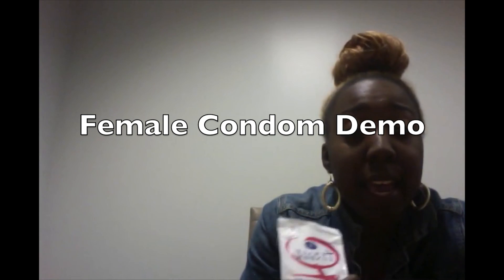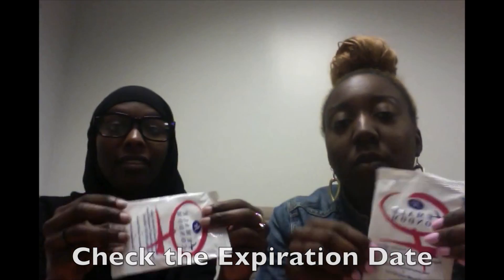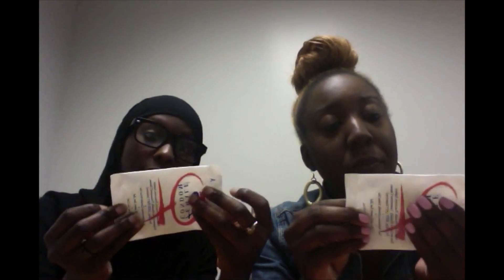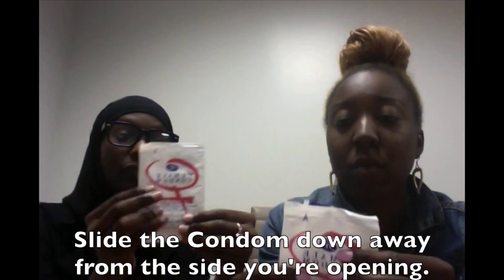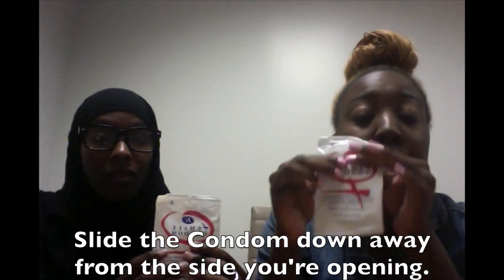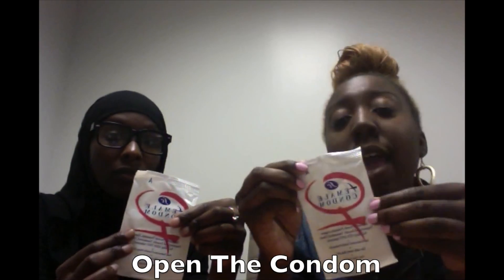Okay, so today I'm going to be doing the female condom demonstration, with the help of Rama Ahmed. The first step in using the female condom is to check the expiration date. This one says it expires September 2017, so we're good. The second step is to feel the condom for any bubbles, which means that it does not have any holes. And the third step is going to be to push it down — push down the condom away from actually opening the package. And the fourth step is going to be to actually open the condom up.